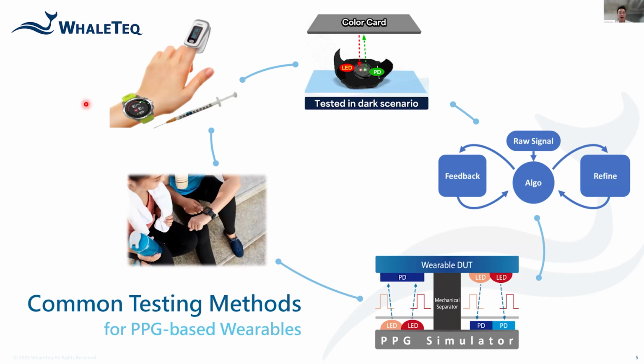Clinical trial or clinical validation is the golden guideline. It directly compares the wearable's readings against the invasive ABG test using CO-oximeters. It is, of course, authentic but costly. Most manufacturers will take this approach at the end, or whenever they are confident enough to apply it to their device or prototype at each build. So this is what happens when you go serious for medical grade. This is the destination, we can say.